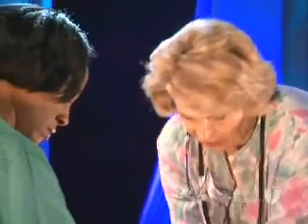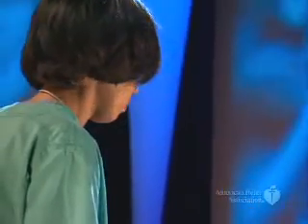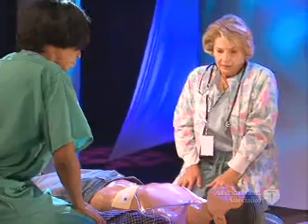Analyzing heart rhythm. Say clear. If the AED finds a heart rhythm that can be treated with a shock, the AED will tell you so. Shock advised. Stay clear of patient. Deliver shock now. The AED will then tell you when to push the shock button.